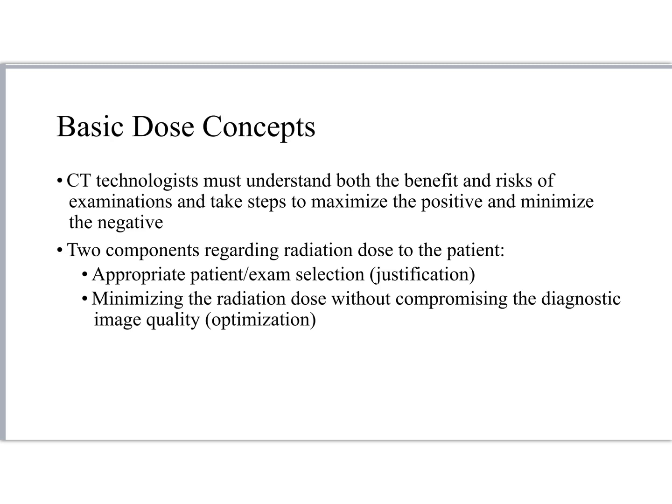And again, this will require some discussions with the health physicist, with the radiologist. Is this sufficient examination information? Is this a good quality image at this reduced dose? As well as knowing how the technology itself works.